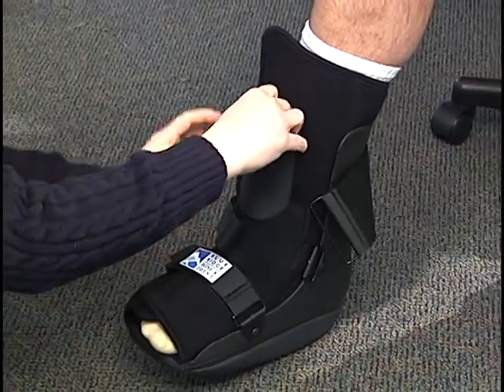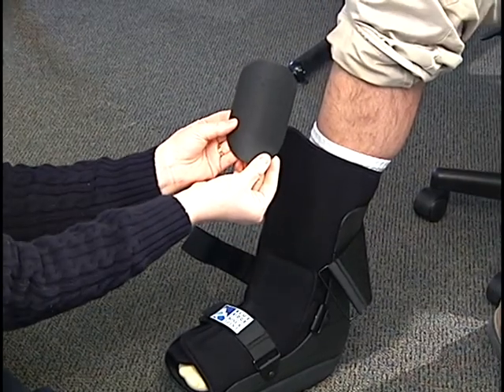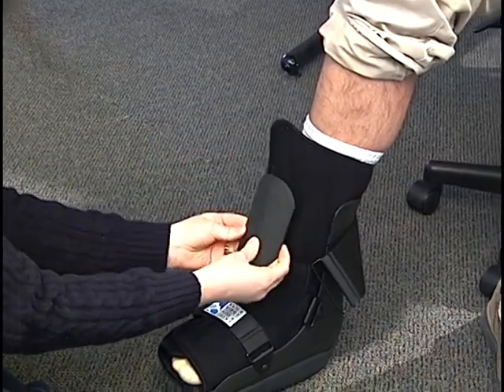Now is there a reason to hold it up toward the camera? And then back down against that area.